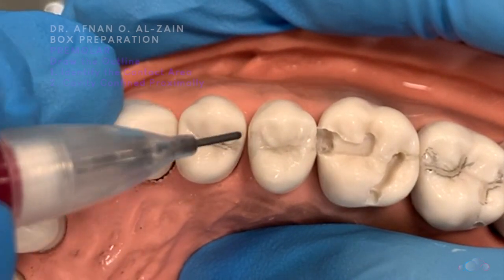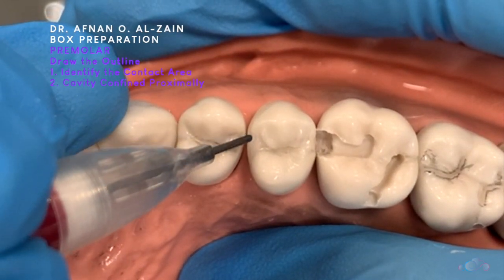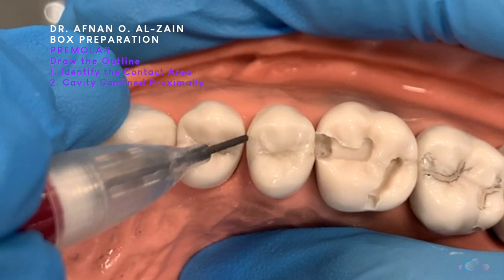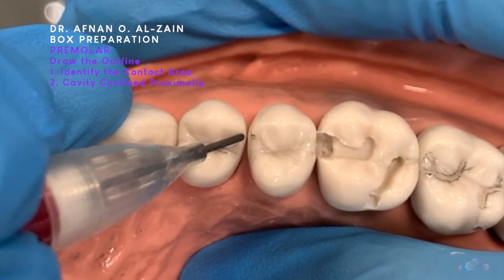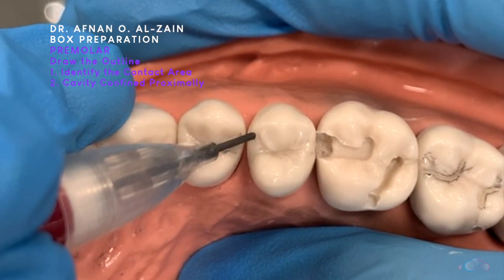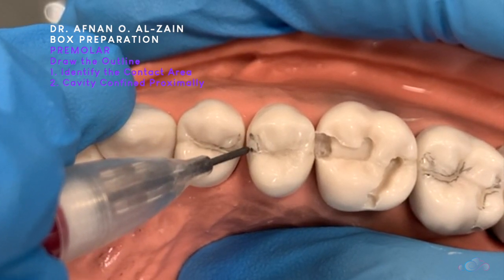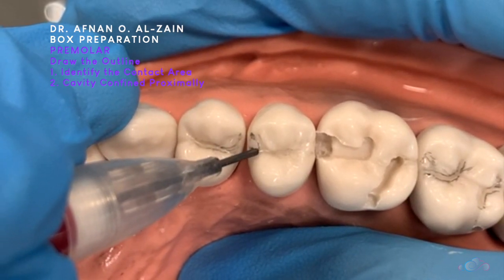So as we did in class 2, we are just going to identify the final contact area here with the neighboring tooth. Then we are just going to go down.